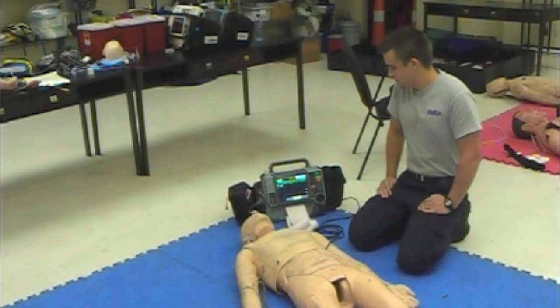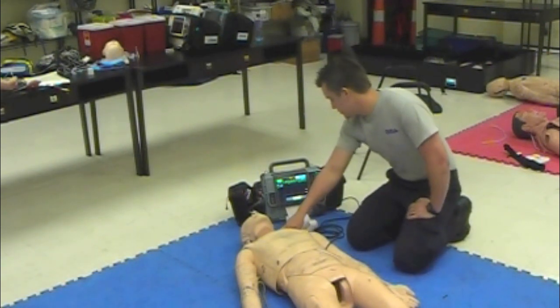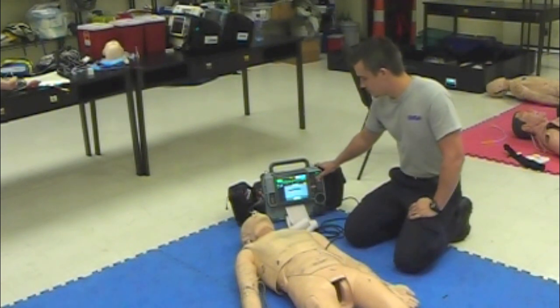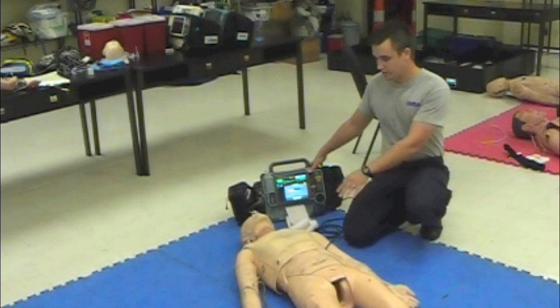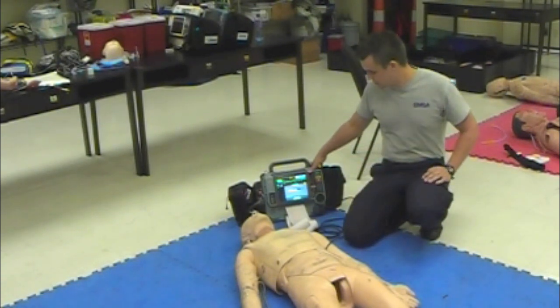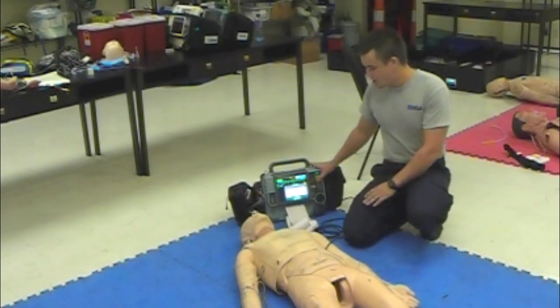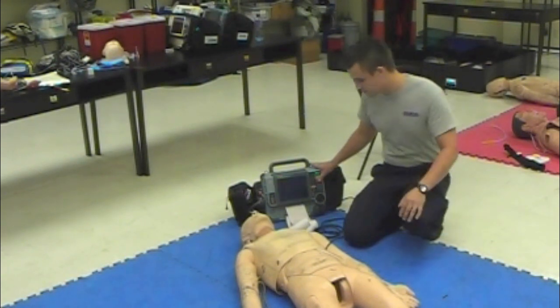All right. And it's been 2 minutes. Okay, we're going to do a pulse check. I see VFib on the monitor. Okay. Assuming no pulse. No pulse. Okay, so we're going to charge up to 360 once again, as we're still doing ventilations and compressions. Okay, off compressions, off ventilations. We're going to shock on 3. Ready, 1, 2, and 3. Shock's delivered.